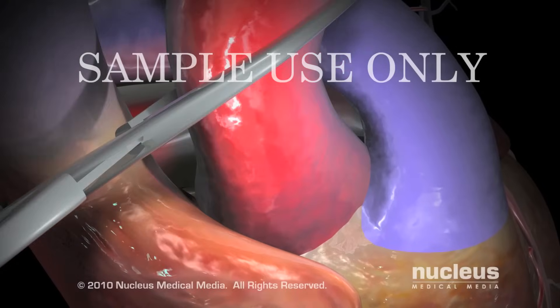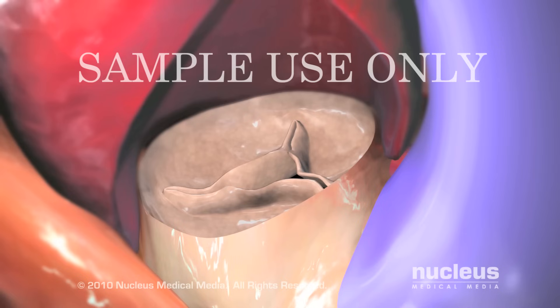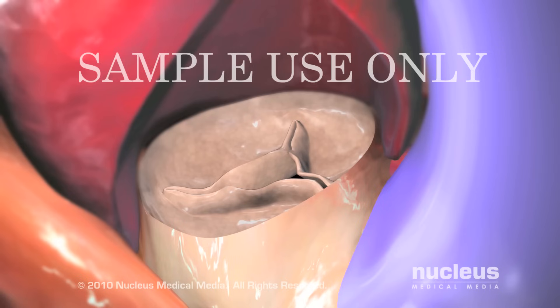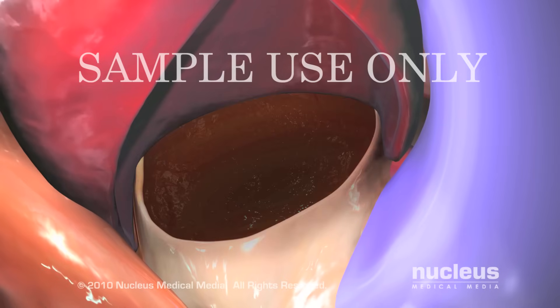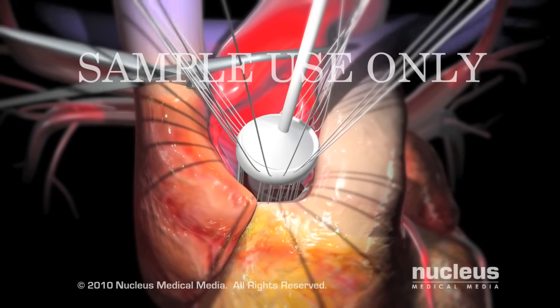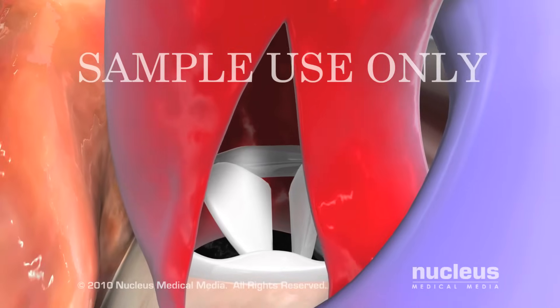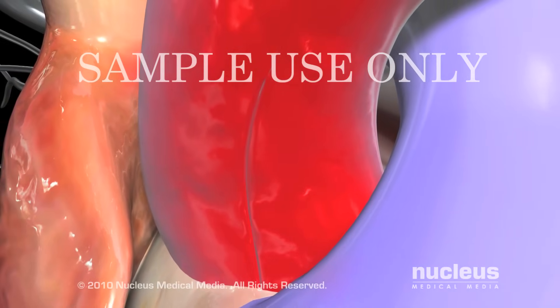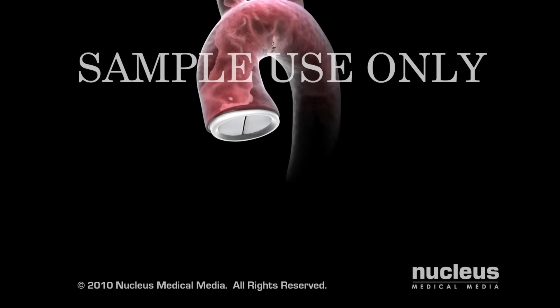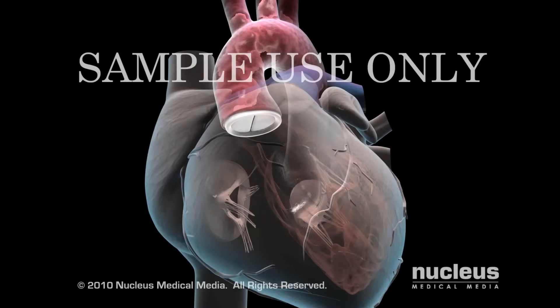Your surgeon will open the aorta to expose the aortic valve, make an incision around the edge of the damaged valve and remove it. Your surgeon will then carefully sew the replacement valve into place and close the aorta with stitches. At this point, blood will again be allowed to flow into your heart to check the function of the new valve.